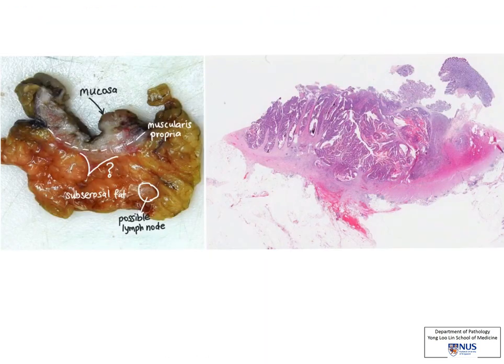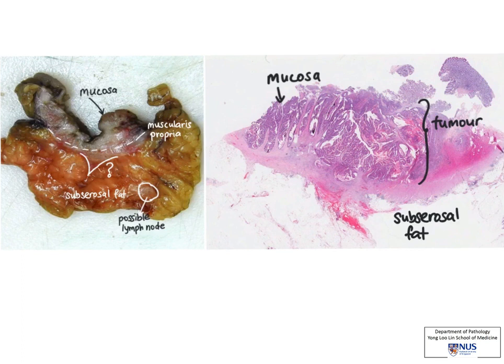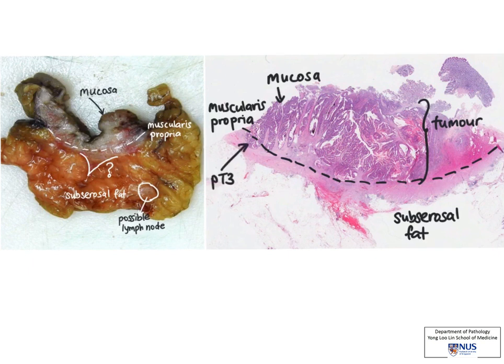Here is the corresponding histological image of the slice. To orientate again, here is the mucosa, the tumour occupying the submucosa and muscularis propria, and the subcerosal fat beneath. The dotted line delineates the extent of the muscularis propria, and the tumour appears to be dipping into the subcerosa and will be considered T3 in the TNM staging. If the tumour invades further into the serosa, it will be considered T4. The hardened and whitish area previously seen on the gross specimen turned out to be an area of fibrosis devoid of malignant glands.